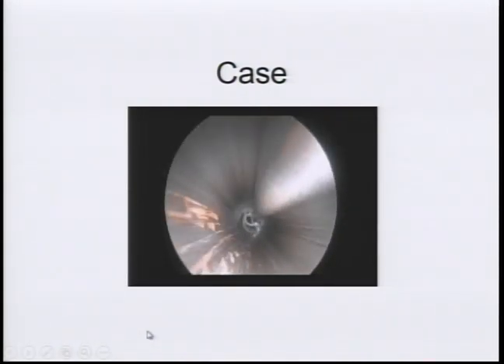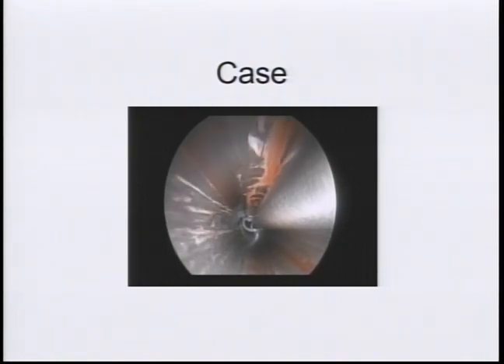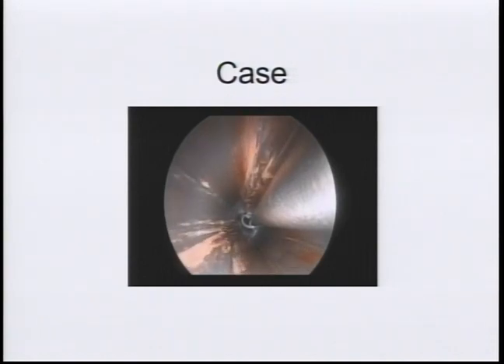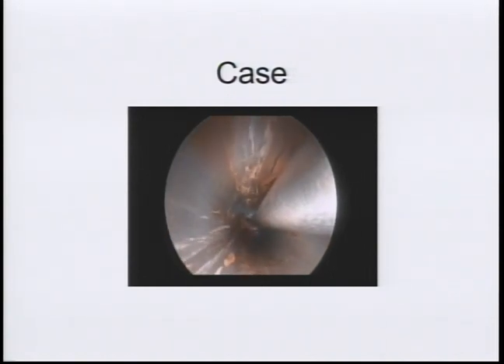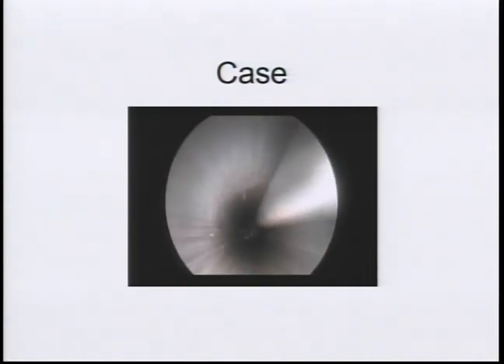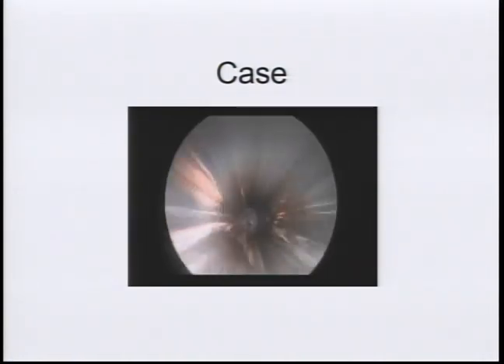So after all this tumor was removed, she still had pretty bad compression of the airway, and so to stabilize that, we're putting in a stent. It's a silicone Y stent that will sit there and just keep the airway open. And these are palliative interventions, so this is something that we would hope would stay there until additional therapy is delivered that allows the lesions to shrink or the patient dies. It's meant to improve shortness of breath, improve quality of life.